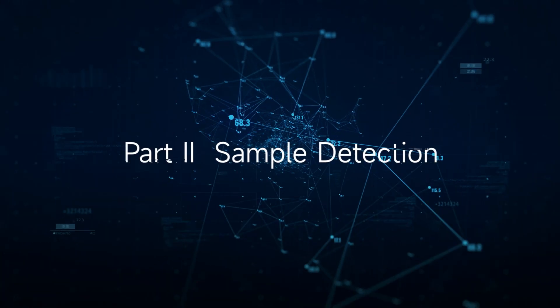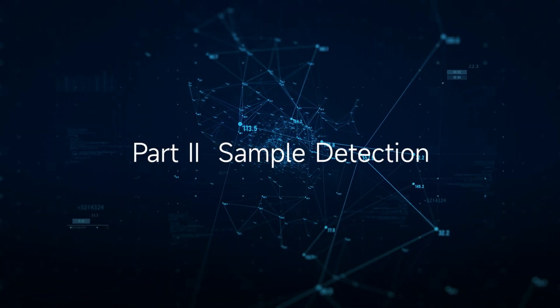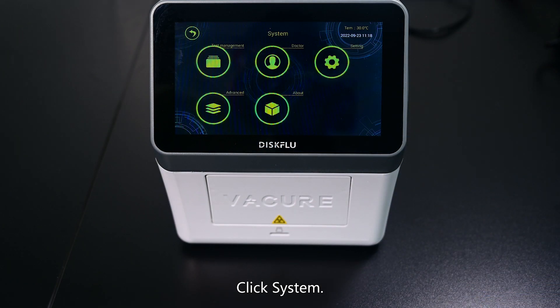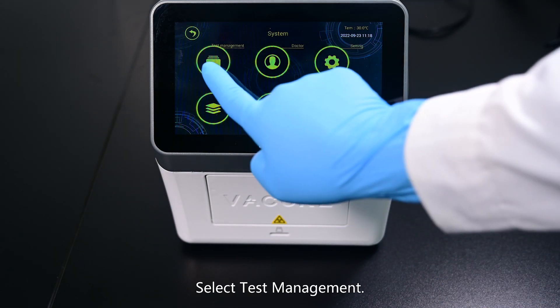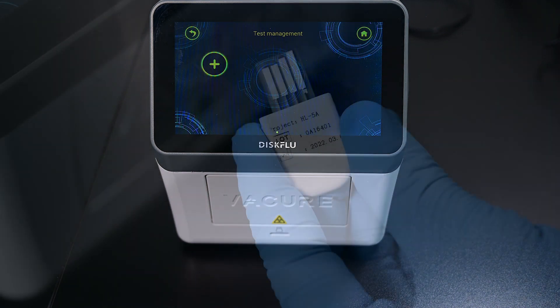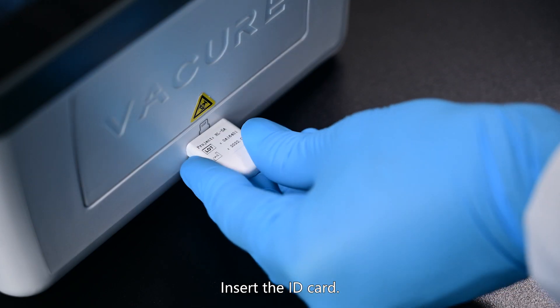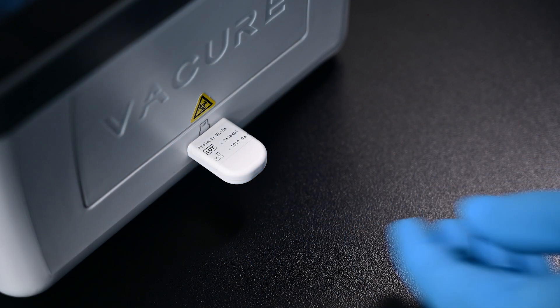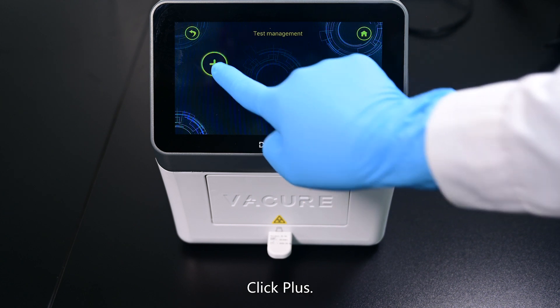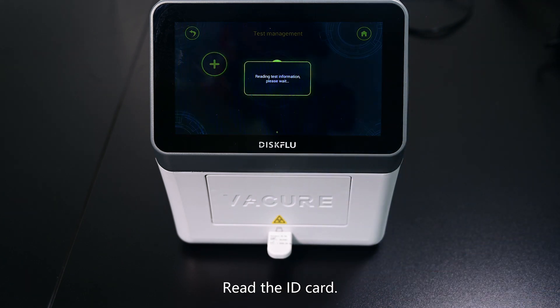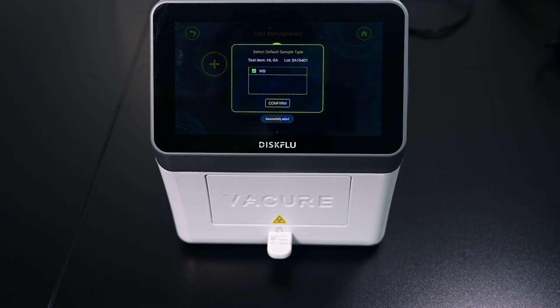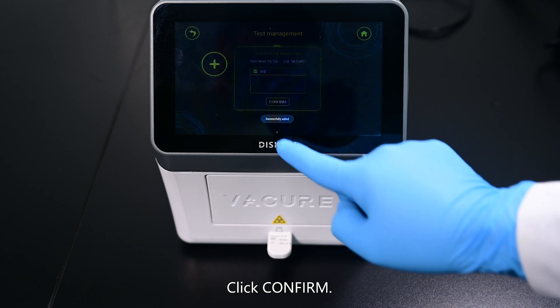Part 2: Sample Detection. Click System. Select test management. Insert the ID card. Click plus. Read the ID card. Click confirm.